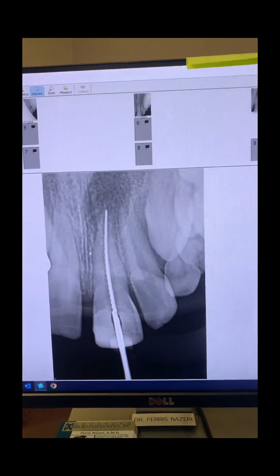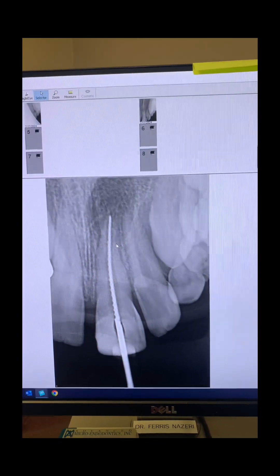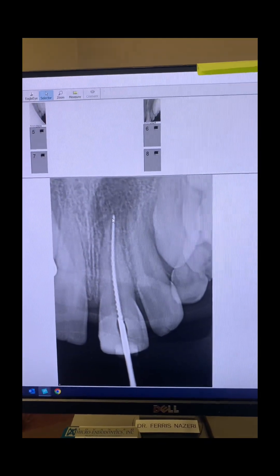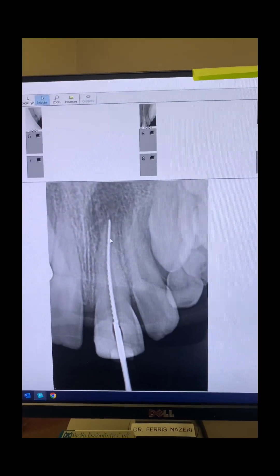As soon as I opened the tooth up, there was purulent discharge. I used microsuction and suctioned it all out. Of course, 6% sodium hypochlorite was used during instrumentation. The apical diameter turned out to be over 60, so regardless, we were doing apexification anyway.